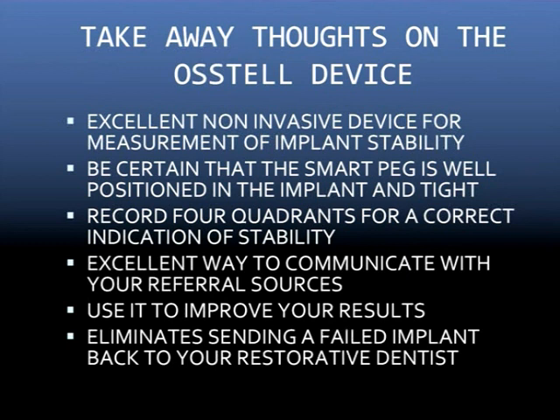It allows you to be certain that the smart peg, it's important for good readings to make sure that the smart peg is securely placed into the implant. You'll get false negative readings if that is not totally engaged in the implant. Record all 4 quadrants, I think, to get a correct understanding of what's really going on with that implant.